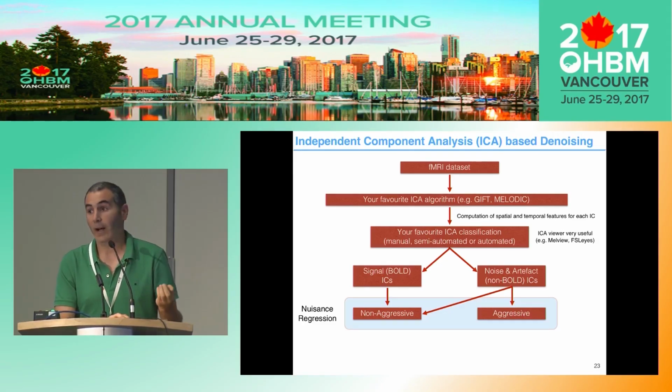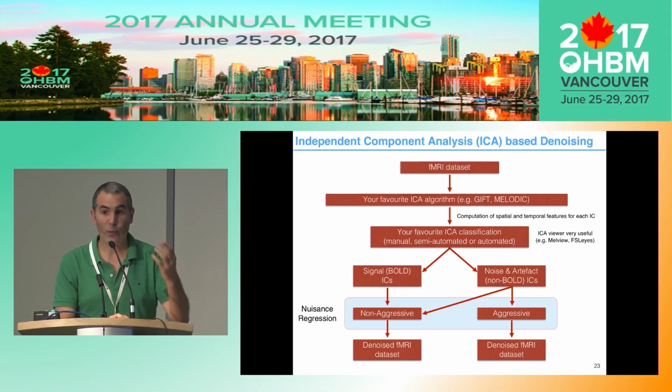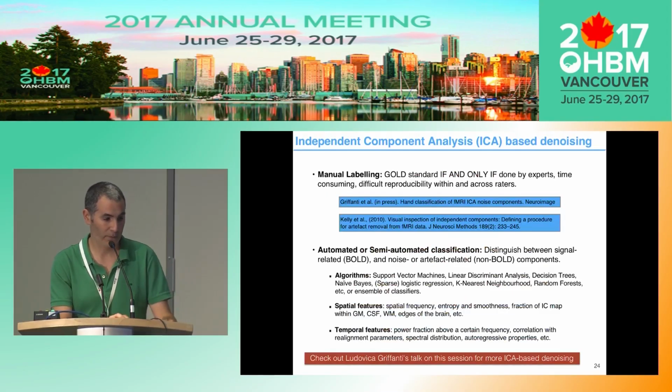Or in an aggressive approach, you will only include the time courses related to the noise components, and then you remove the part of the signal explained by the time courses of the noise components.